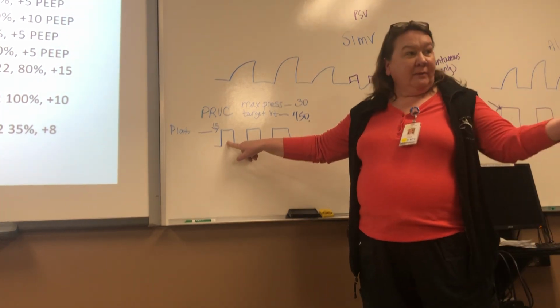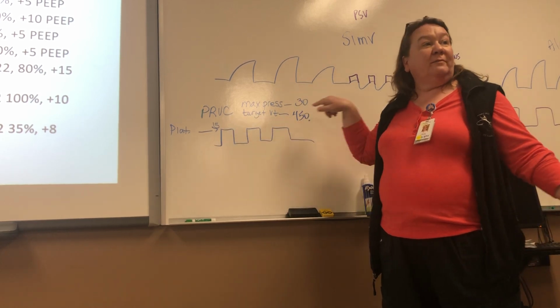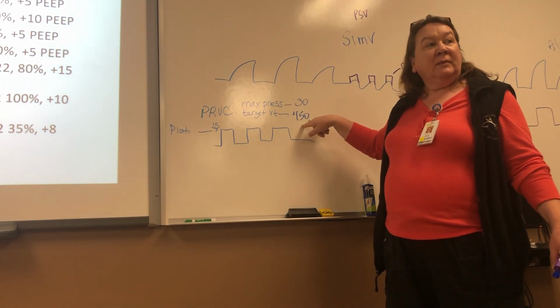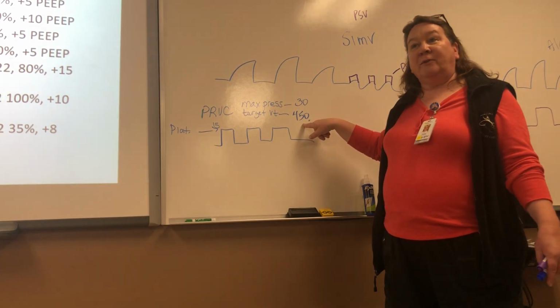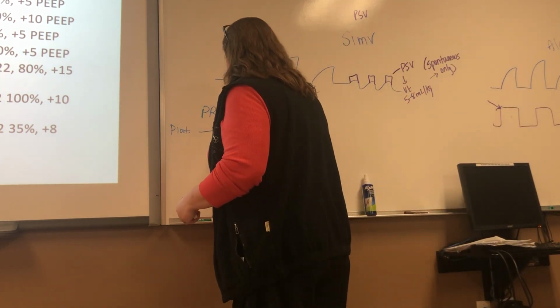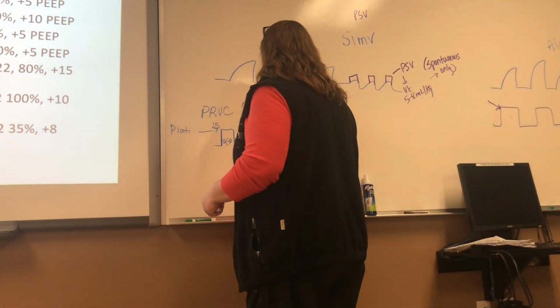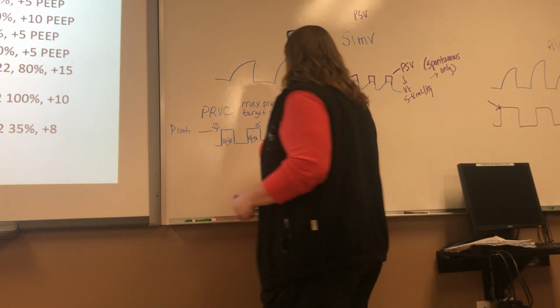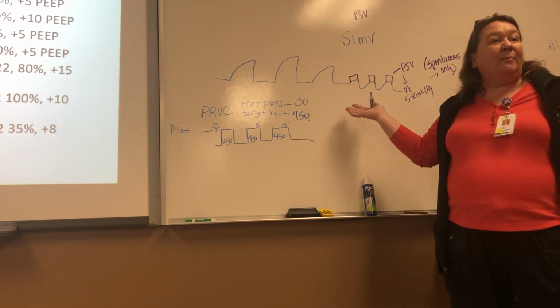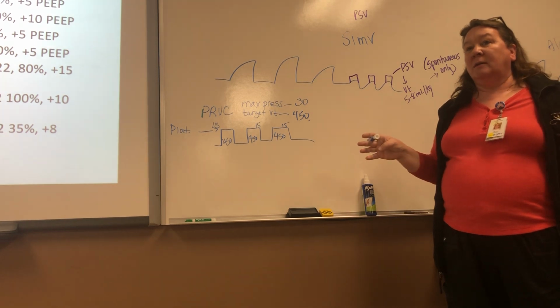So test breath, do the plateau, the pressure's 15, then that's going to be the starting pressure the ventilator uses in PRVC to try to get 450. So it's always monitoring to get 450. So let's say it gets 450. And it's never going to be exact, I'm just doing this to demonstrate. So it's going to stay at 15 and it's going to go, oh good, I'm using 15 of pressure, I'm getting 450, I'm happy. Because you're getting the target tidal volume that you want.